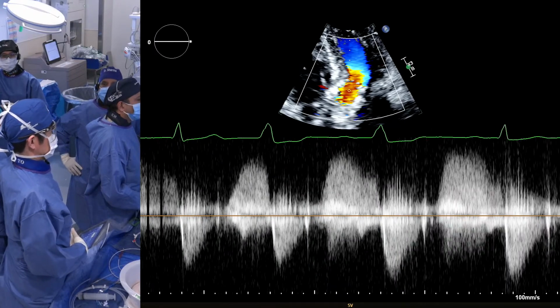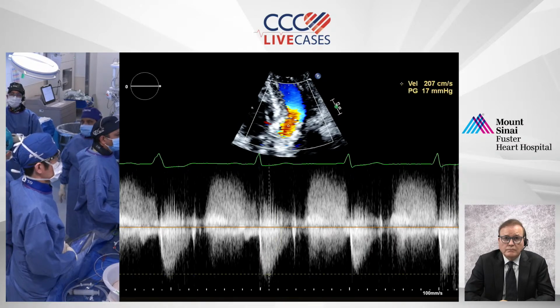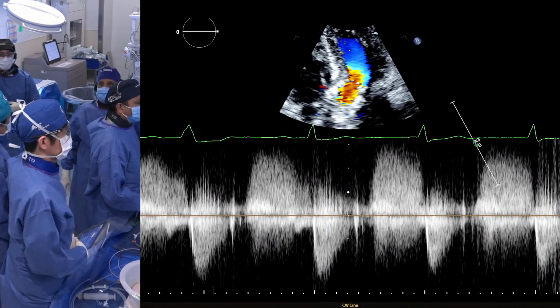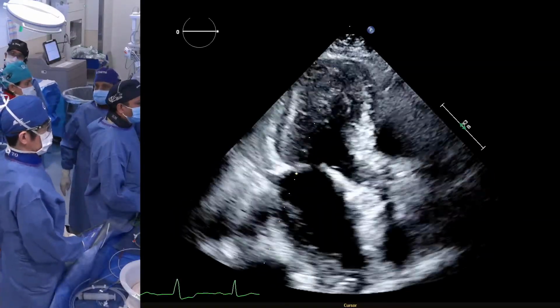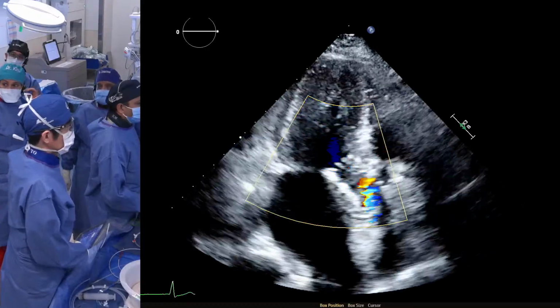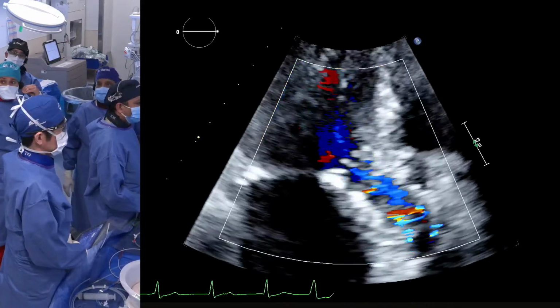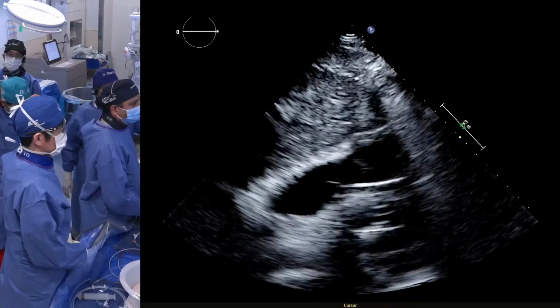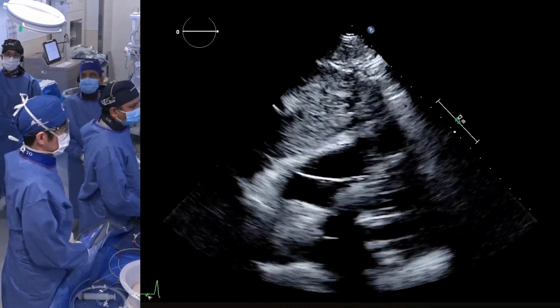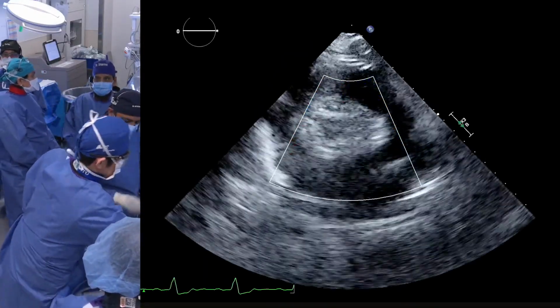Also, we have another question. What about fixing the paravalvular leak with any device? Yeah, that's what he just talked about. So plugging is very difficult in the aortic position, especially for a tall valve. And also remember, it's not like a discrete hole. In, for example, a mechanical valve, you have a prosthesis with a round hole and a native anatomy that's round. In TAVR, you have a native anatomy that now has calcified leaflets. You don't know where the gap is, where the hole is. So it's very hard to go on a fishing expedition to find that real hole. It's very different from, let's say, plugging a mitral valve or a prosthetic valve. It's a totally different kind of technique.